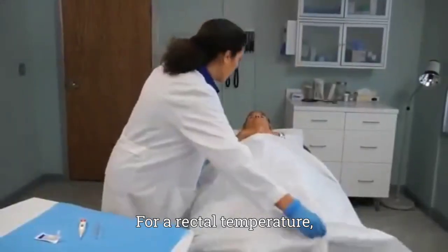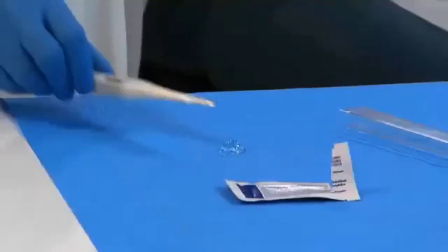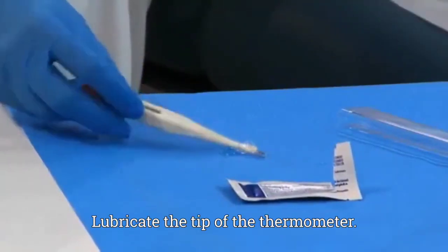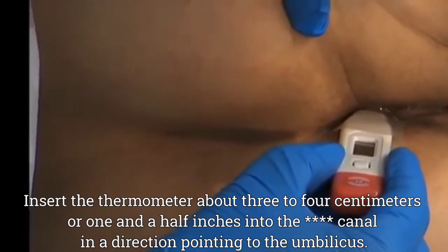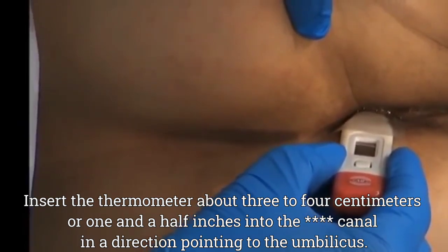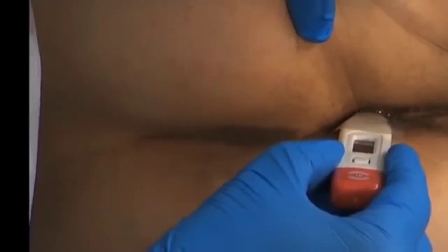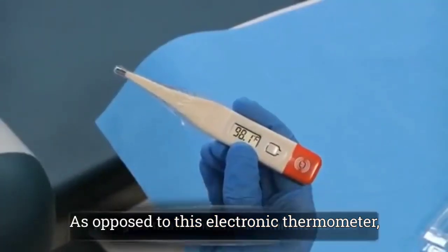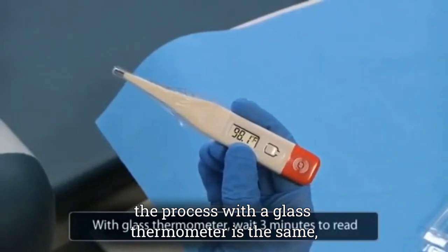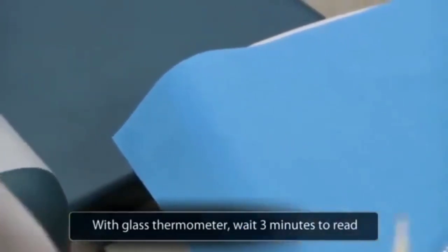For a rectal temperature, ask the patient to lie on one side with the hip flexed. Lubricate the tip of the thermometer. Insert the thermometer about 3 to 4 centimeters, or 1.5 inches, into the anal canal in a direction pointing to the umbilicus. Remove it after the recommended time period, then read. As opposed to this electronic thermometer, the process with a glass thermometer is the same, although you must wait 3 minutes to read the results.